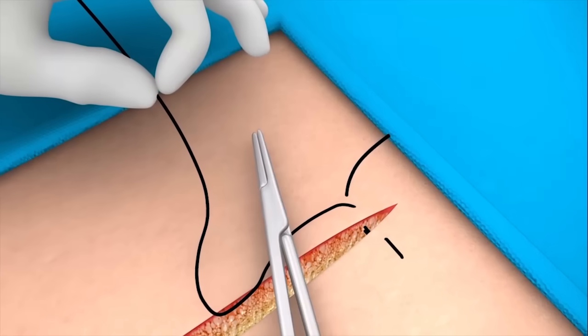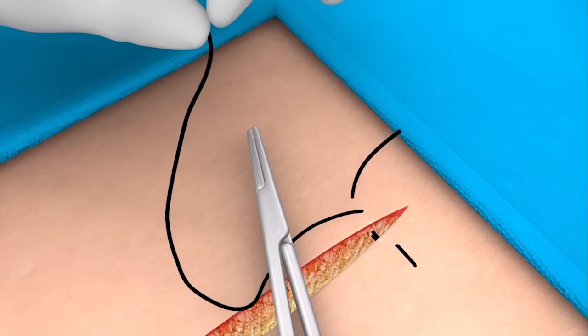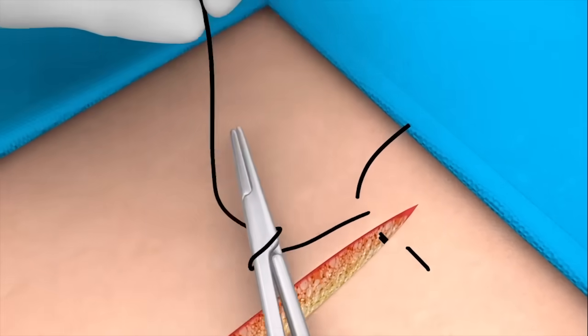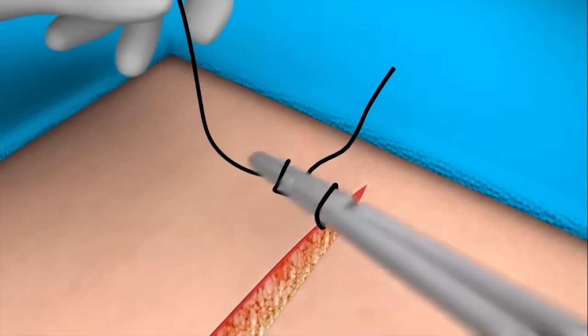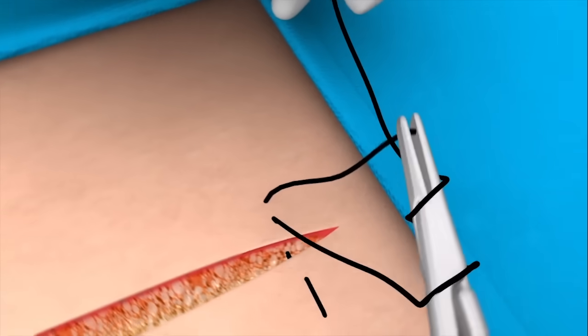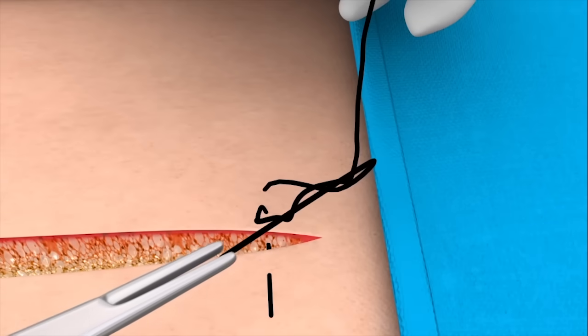When tying the knot, make a double forward throw first by wrapping the suture twice around the tip of the needle holder. Grasp the end of the suture with the needle holder and pull it through the loops as shown.